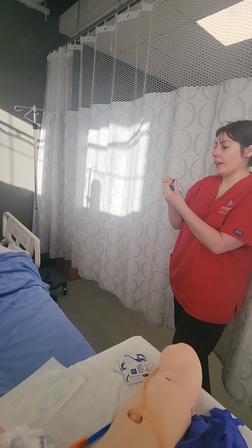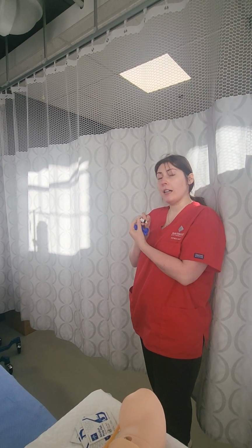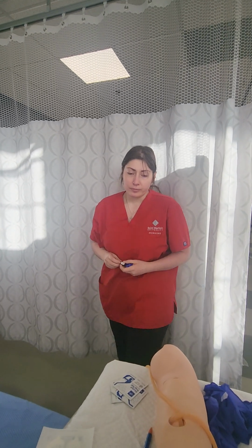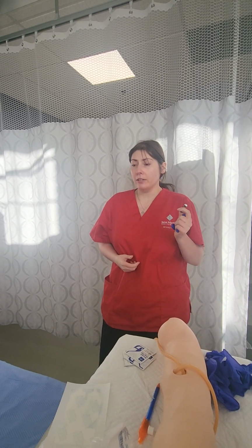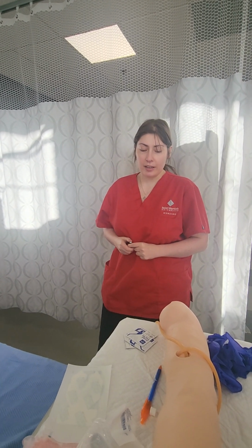So right here I have 10 milligrams of morphine per 1 ml, and the order is for 3 milligrams, so I'm going to be giving 0.3. This is an IV solution and we're going to be giving it through IV. He is in pain, 6 out of 10, so this is for the right reason, the right route, the right patient, and the right time, because he hasn't had it in a while, so we're good on that account.